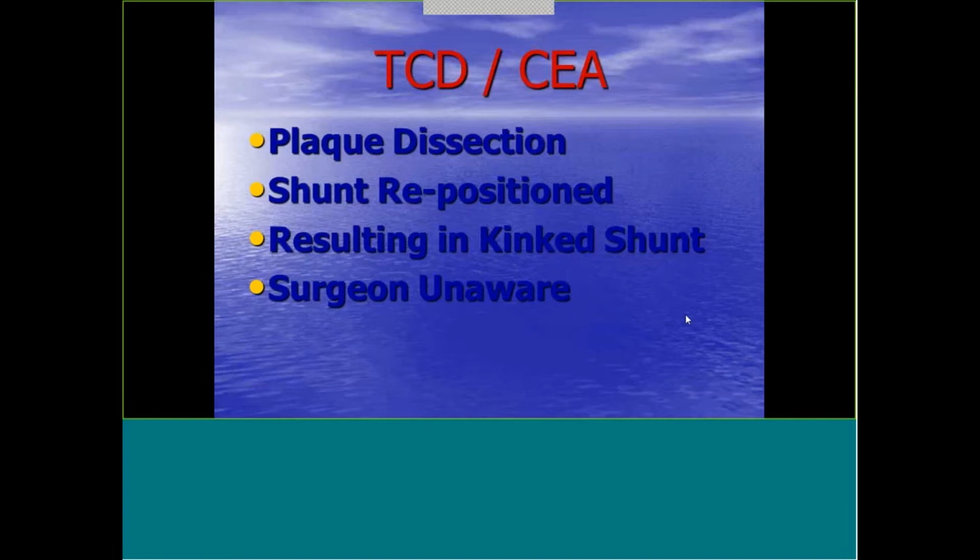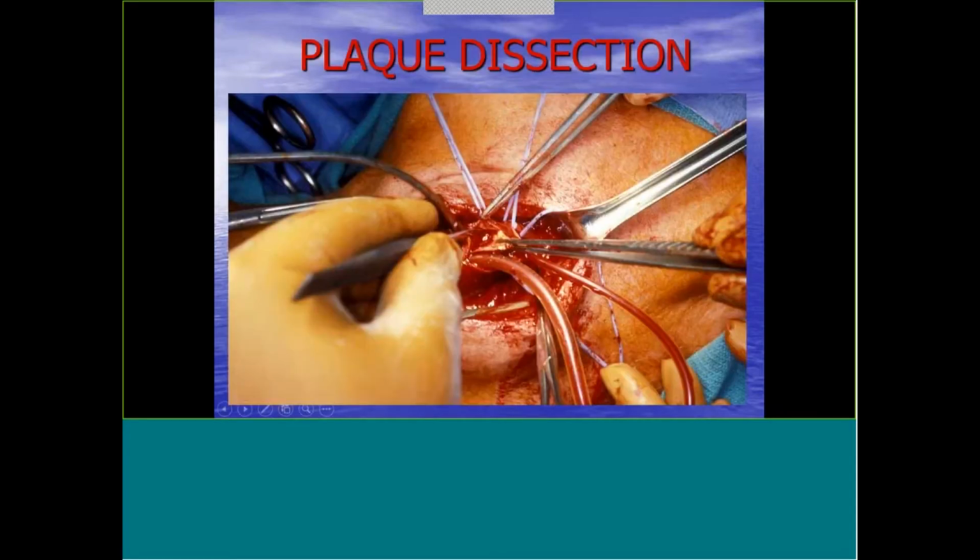So this is showing you how they took that shunt that I showed you before, and they're moving it way down here so they can pull this plaque out all in one piece. They don't want to take this plaque out piecemeal. They want it all out in one piece if they can. They don't want to have any little shells of plaque sitting up there inside the vessel. They have a little tool that looks like a duckbill that they scoop these things out with.